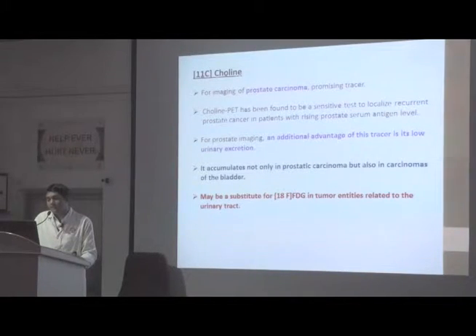An advantage is that the tracer uptake in urinary excretion is very low. It accumulates not only in the prostatic carcinoma but also in carcinomas of the bladder. It can be a substitute for the F18 FDG for tumors related to the urinary tract.